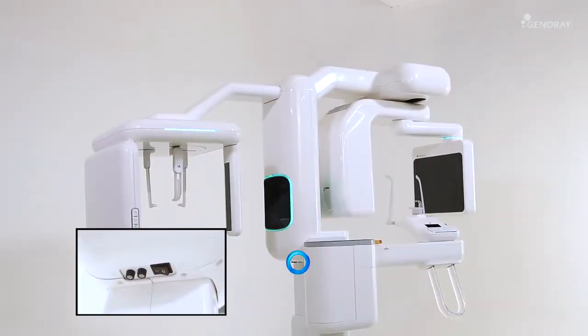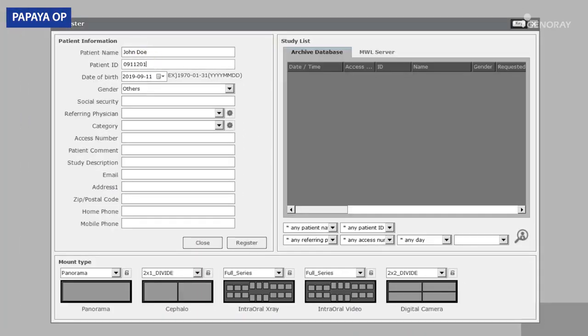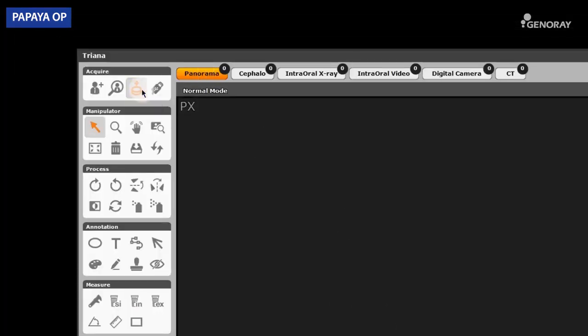To begin with, turn on the power. Register the patient in Triana and click on the Acquire Image icon to initiate the Papaya operation panel.